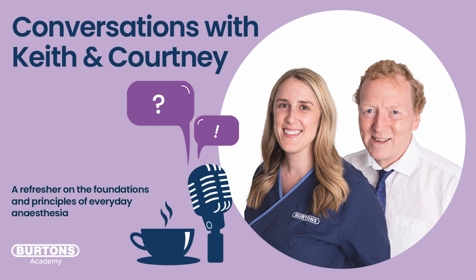So I think this leads us to think about the effect of compliance on the patient. And we said volume cycling is the most common, and we just saw the effects of restricting the volume as a rising pressure. But just very quickly, let's think about pressure cycling and the effect of changing compliance, and what effect it will have on the patient. So just to recap, when you volume cycle, you give the volume and the pressure will end up being whatever the pressure will end up being. That's it. So when we're pressure cycling, it's reversed. We ventilate to a pressure, and the volume ends up being whatever the volume will be.